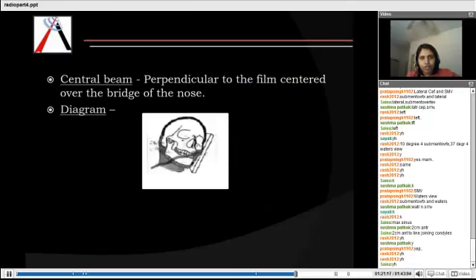Okay, so this side's condyle and this side's angle will form a horizontal line. We have to tilt so much that this particular condyle and this particular angle form a horizontal line.